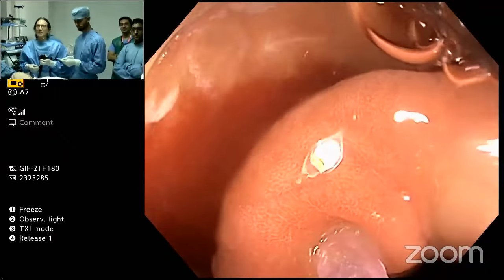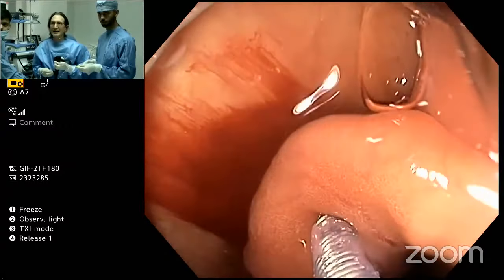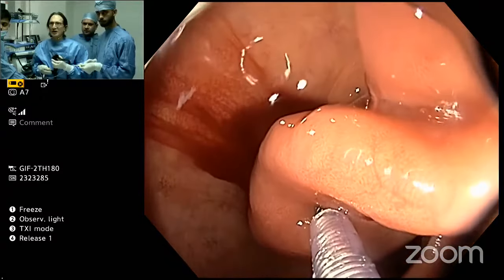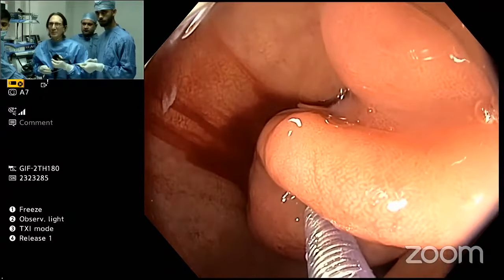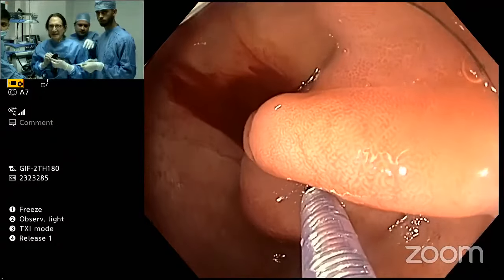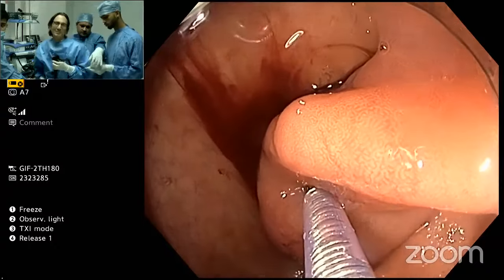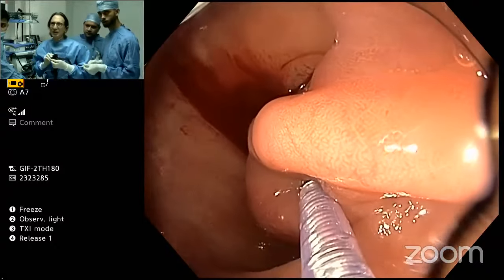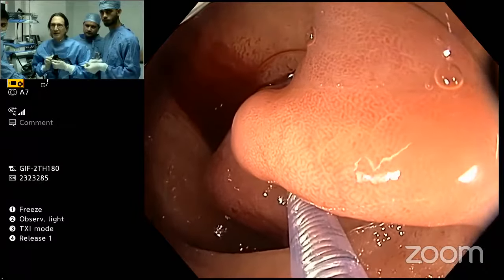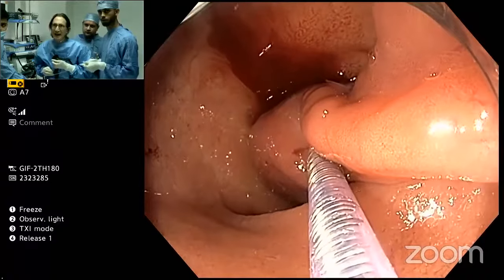All right, so I'm up against here. Advance forward, please. Okay, start to rotate, please. I think what happened is it dislodged from the tissue, because a lipoma is very, very soft, and it's kind of hard to engage a lipoma. If this were a GIST, stromal cell tumor, no problem. Keep rotating because it's got to go a little bit deeper. I think that was the problem. It pulled out because I didn't go deep enough, or it's just hard for it to be. So I think it's in there now. Okay, good. And then stop.